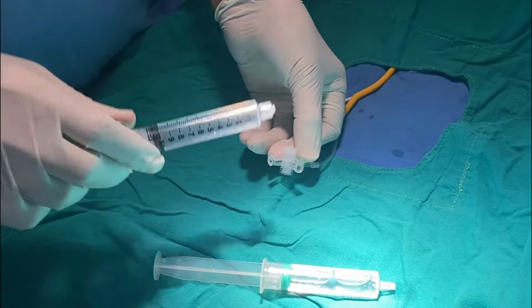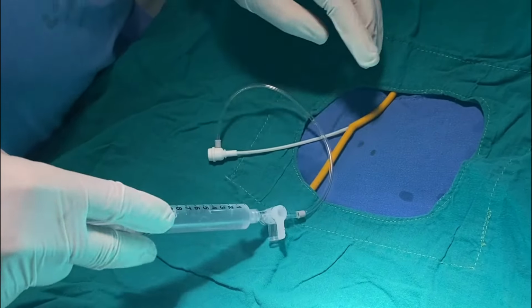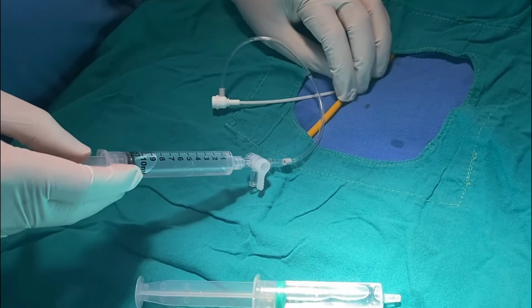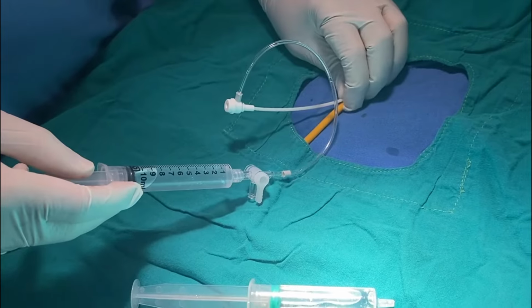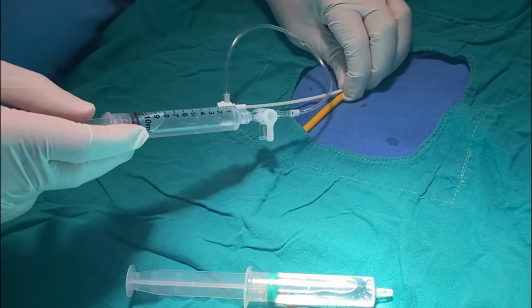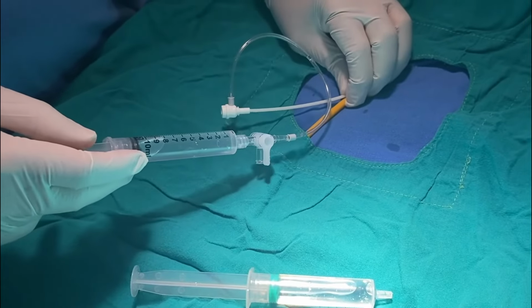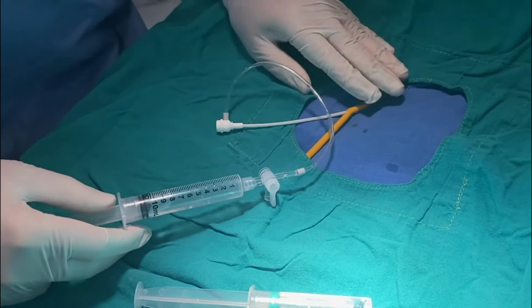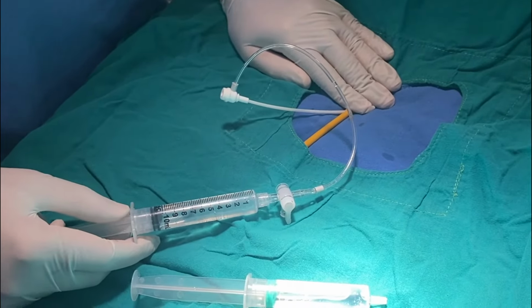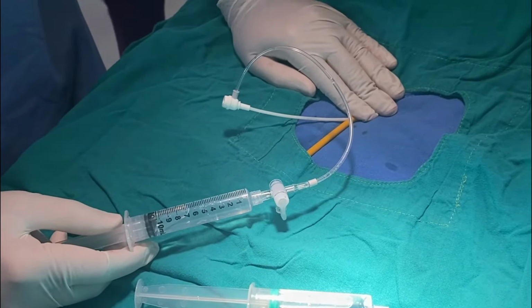What should be the next step? Take contrast. Aspirate always, see that no air is coming, then take an injection and take a DSA of the femoral artery. We should very carefully check that DSA to see if there is any leak, any arteriovenous fistula, any abnormality, and whether the puncture is at the correct position and is adequate and perfect. Always check for minor leaks. If there is a minor leak, what will you do? You have to keep pressing at this point for 2 to 3 minutes. After 2 to 3 minutes, again take a check shoot, and invariably the leak would have stopped by that time.